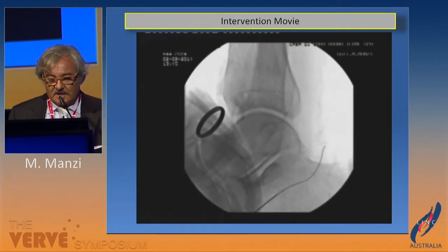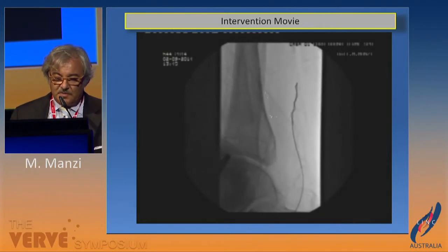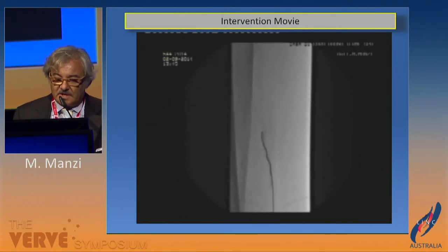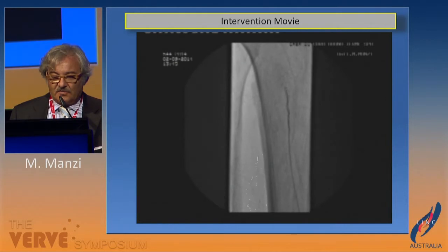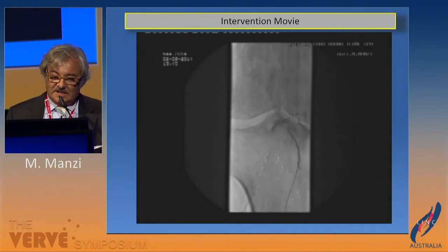This is the puncture. Ask the patient to lift the forefoot to straighten the curve. This is a V18 wire with a loop in a subintimal dissection, rotated in order to keep the loop as small as possible. You can see the calcification of the vessel, supported with a CXI catheter. We arrived finally to discover that there was a high origin of the posterior tibial artery. You can see the wire proceeding in the dissection.